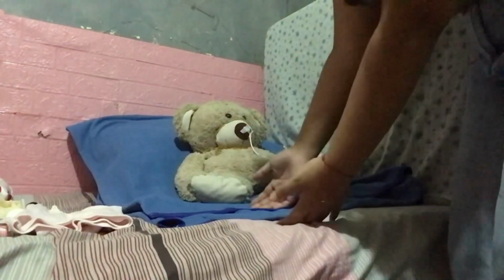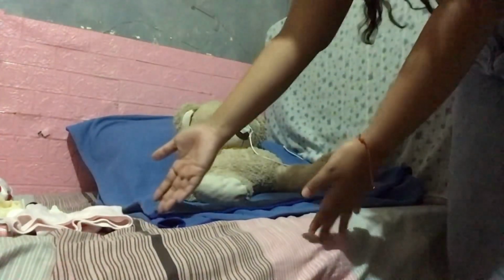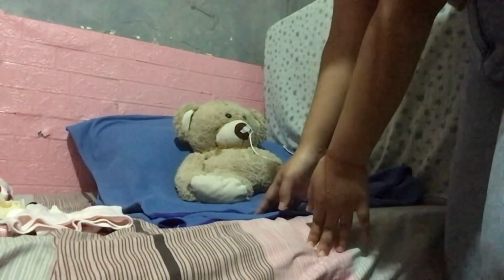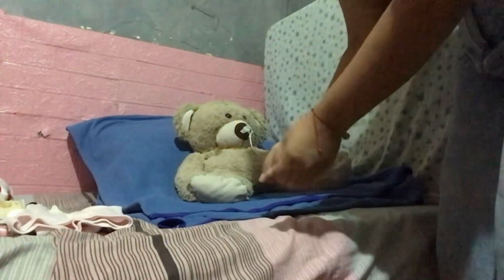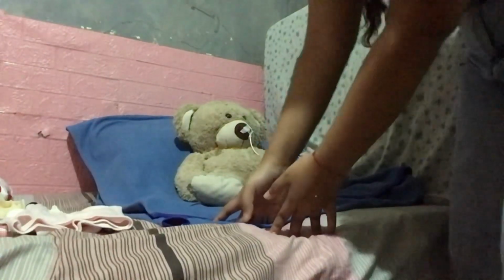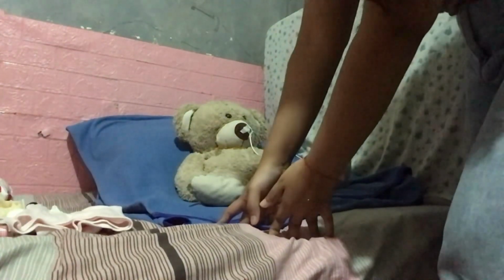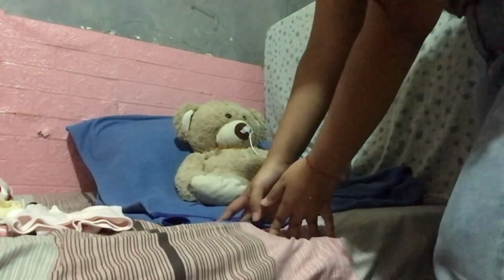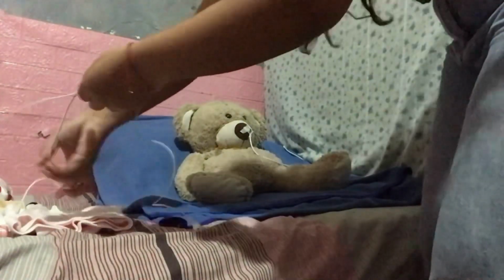Then you have to do the sterile setup. So open the sterile catheter kit and lay out the contents on sterile field. Put on sterile gloves. So just imagine I put on sterile gloves. And then prepare the catheter. So open the catheter packaging without touching the catheter tip. Apply water-soluble lubricant generously to the tip and the first few inches of the catheter. So just imagine this is the catheter.